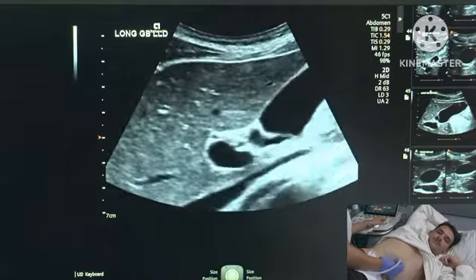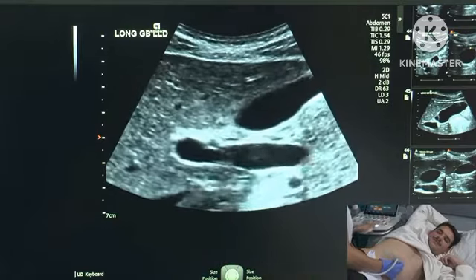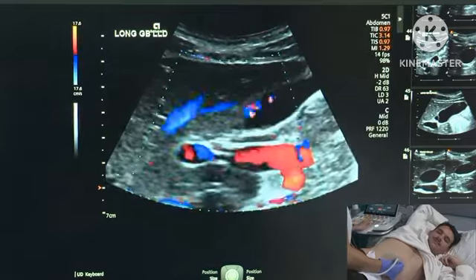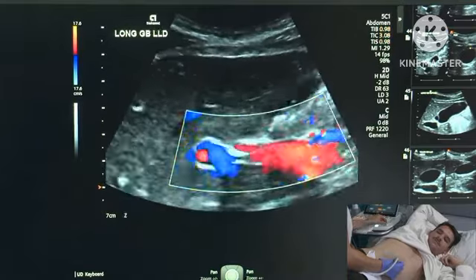Now we can go and take a look at that bile duct, which we expect to see just anterior to our main portal vein. To make sure that I'm seeing the gallbladder, the bile duct, I'm just going to use color Doppler. Because it's going to be filled with bile, I don't expect there to be any flow within it. And then I will change my zoom.